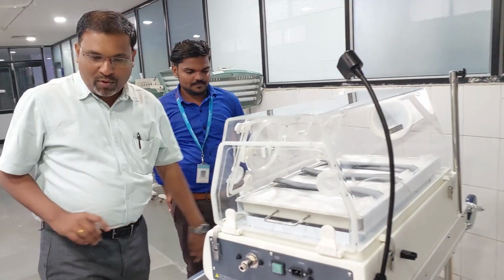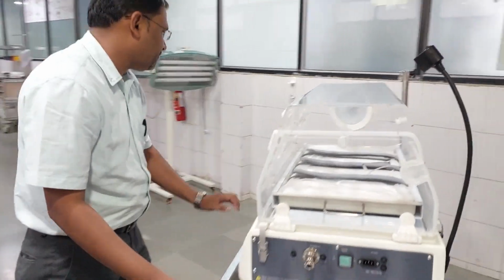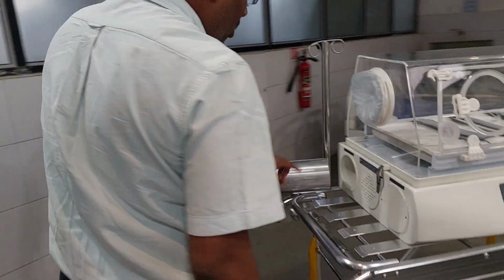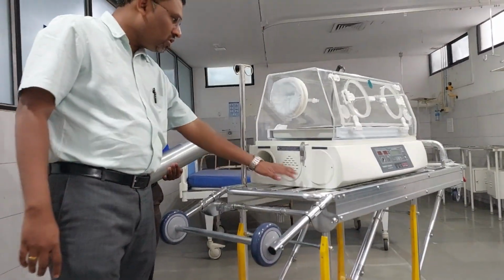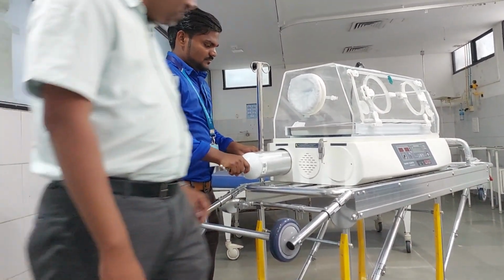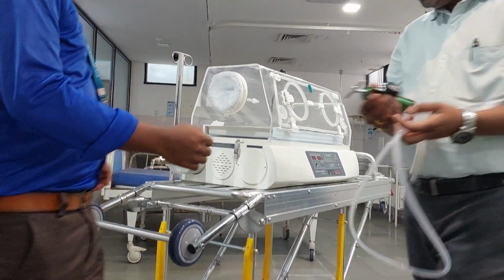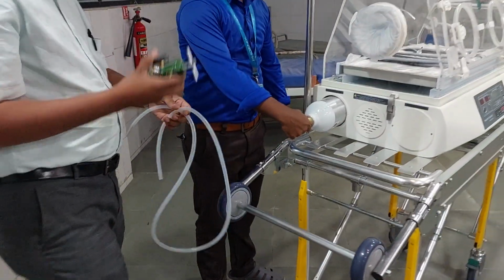After that, they have provided an oxygen cylinder to transport the baby. Now see, they have provided these two slots in which you can install the oxygen cylinder. Please see, this is the way you are going to keep this oxygen cylinder. They have provided this regulator to provide oxygen to the baby.